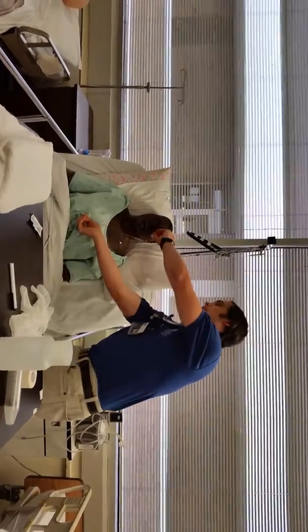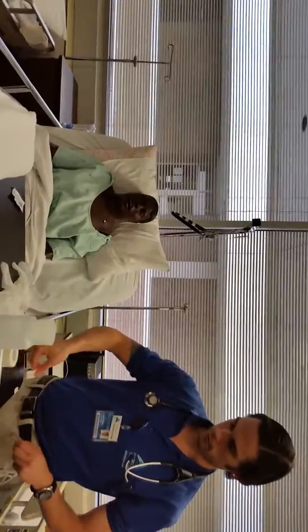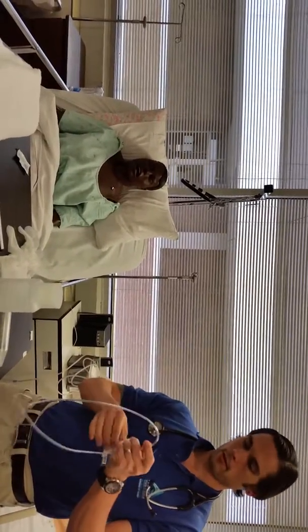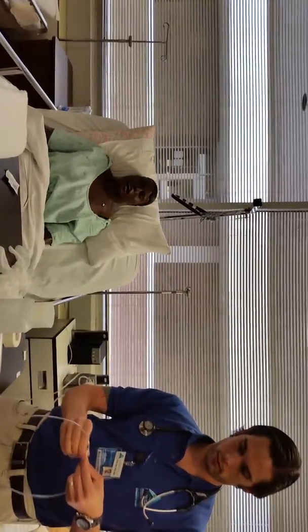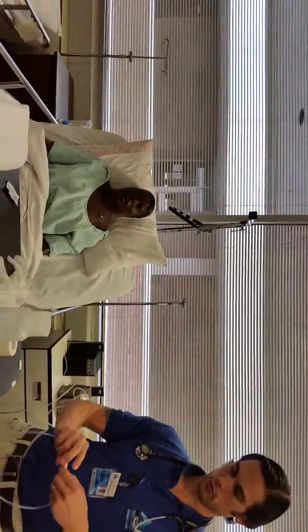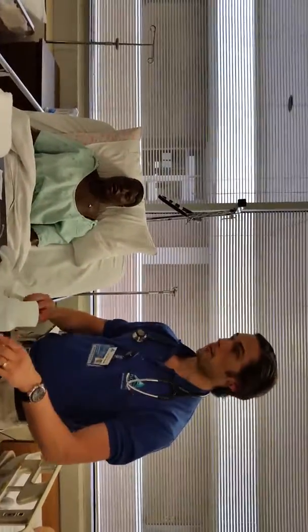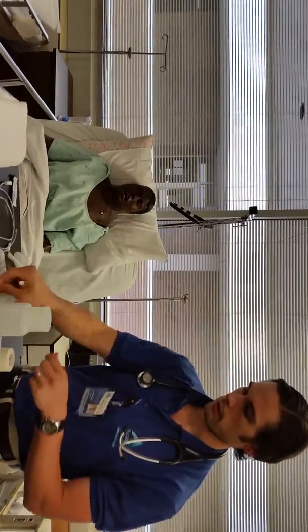There. So, that's our measurement. I'm going to take a piece of tape. All right, so I'm going to place this back on my packaging, and that's set up. So now I would wash my hands, and then I'm going to go ahead and put gloves on.